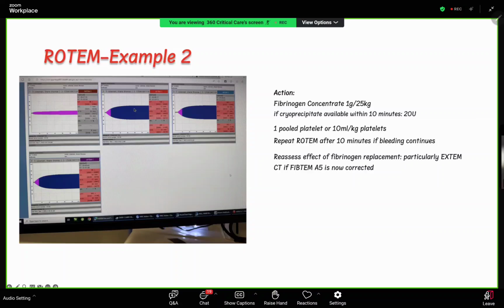Because the increase is around 10, it's not too high. But again, this is just a rough estimate. It's very hard to see how much platelets are contributing to this abnormality as long as you have to correct the fibrinogen first. But again, we sometimes look at the difference. If the difference is not too high, that means there is a contribution from platelets also. Okay.